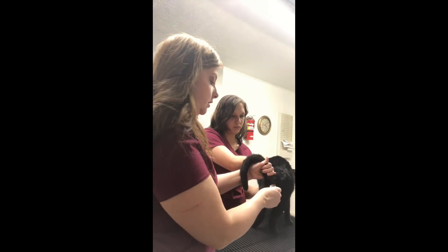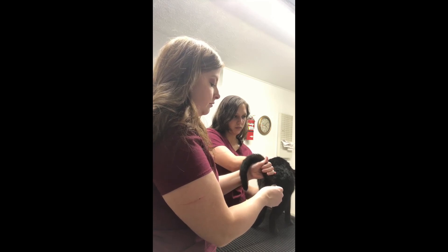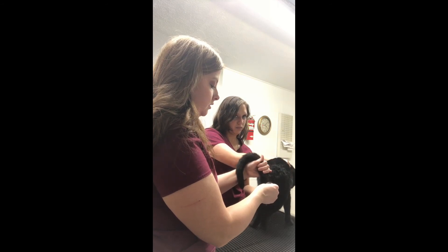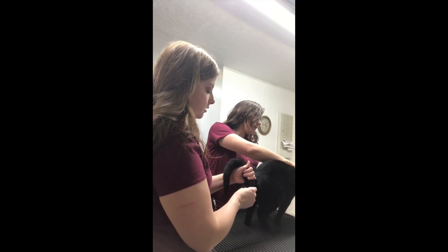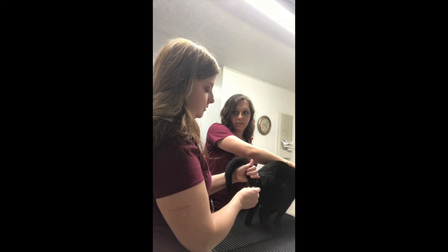The normal range for temperature in a cat is about 100 to 102 degrees, and we really don't like it to be too much over that. It stopped moving — it hasn't beeped yet but we're at 100.9, so she's normal.